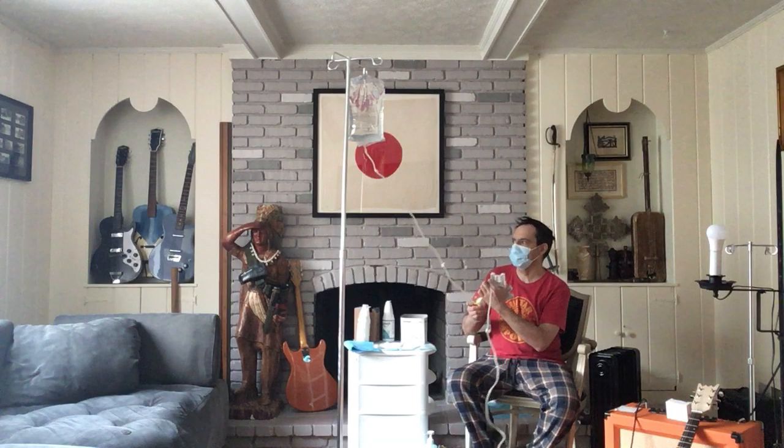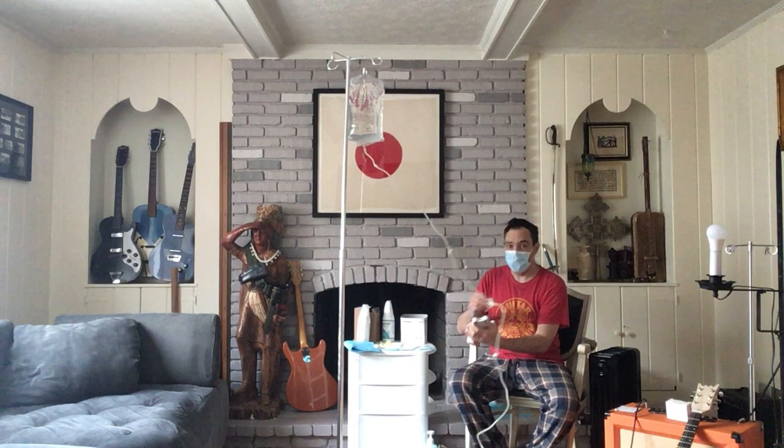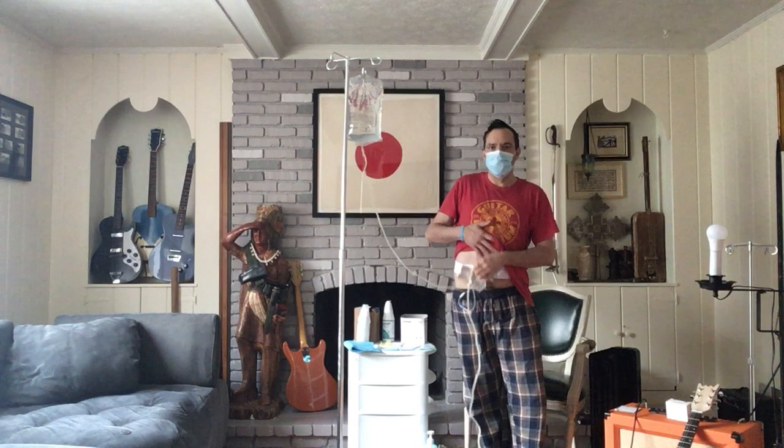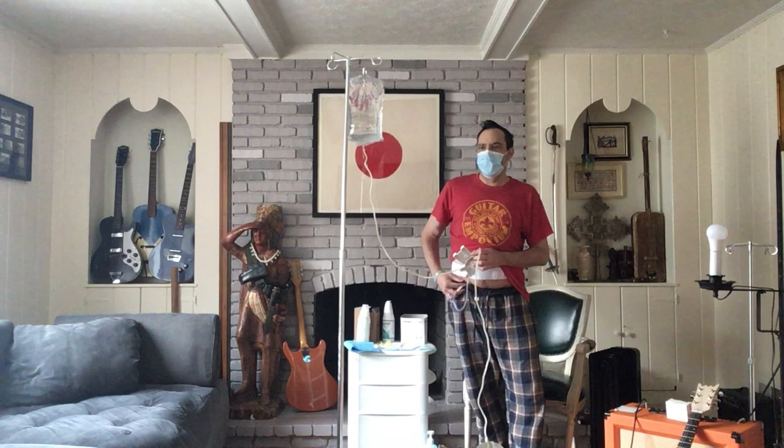I imagine doing this for 4 hours in a clinic with your blood. I did that for a while, and that's called hemodialysis. This is peritoneal dialysis, which involves surgery. I have a port right here. Probably pull my pants up.